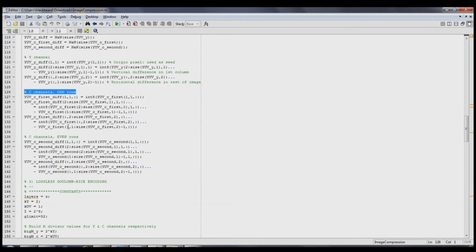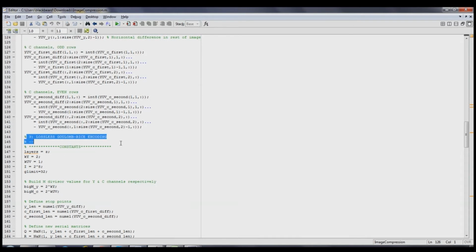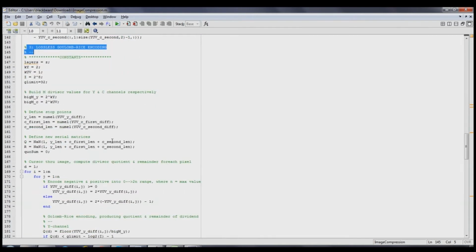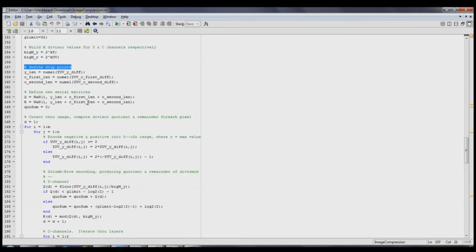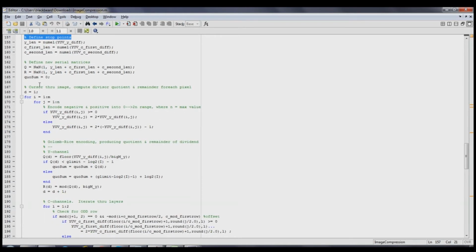And then third, the Golomb-Rice encoding is probably the most difficult one brain-wise to code. So we set some constants here to determine values to divide each pixel by and the pixel magnitude maxes. Next we define some stop points for the lengths. And then we map negative numbers to odd positive numbers and positive numbers to even numbers by multiplying them by 2 with the absolute value.